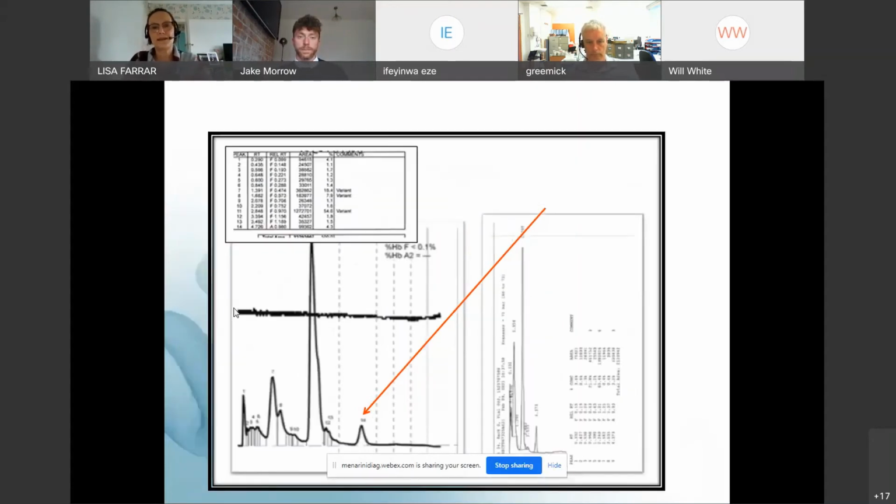The second baby is another 26-week baby. Again, this time you can see that the hemoglobin A peak has an identifier on it, and it's been able to identify this as a 4.3% hemoglobin A. So we can determine that this patient does not have beta thalassemia or beta thalassemia intermedia.